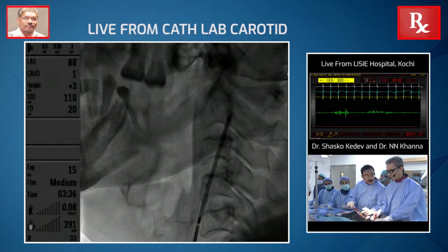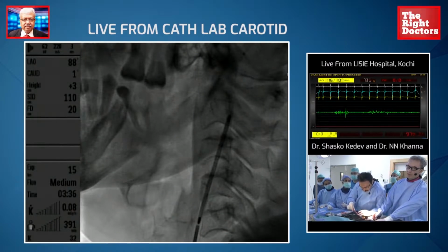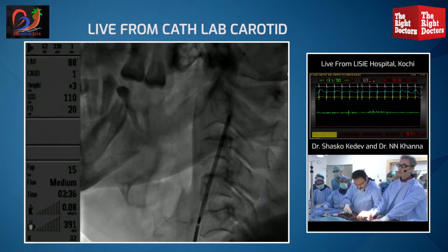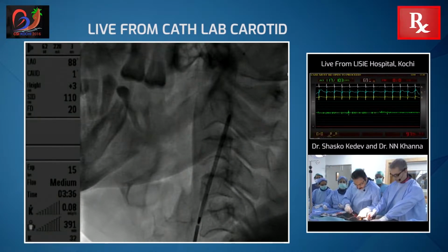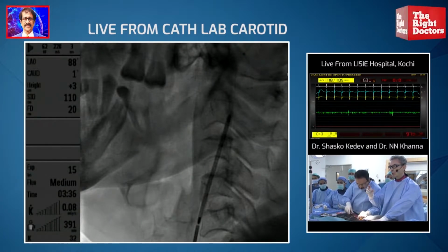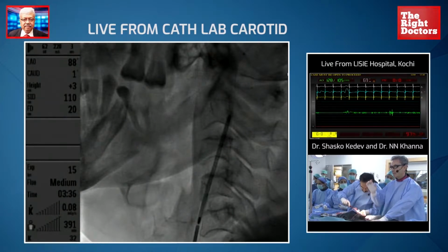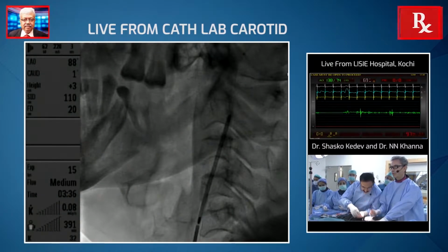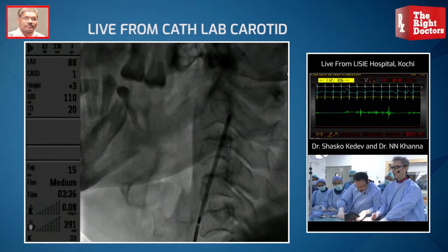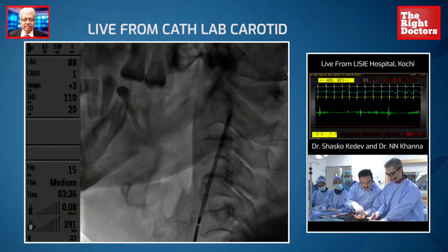How much do we wait after stroke? It depends. Sometimes, if there are no morphological changes on CT and the patient is symptomatic, we try to do it as soon as possible. But if there is some structural brain damage with penumbra on a CT perfusion, and it is a well-defined infarction, then we do not have to do it quickly. We have to follow the patient and decide later. You have to tighten this; there's some air coming in.